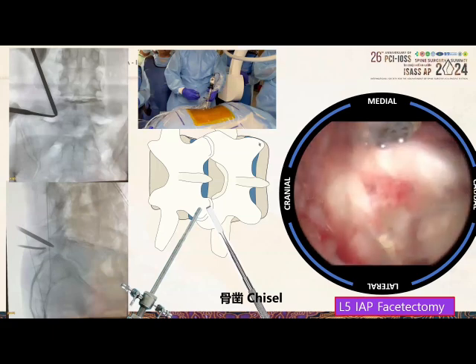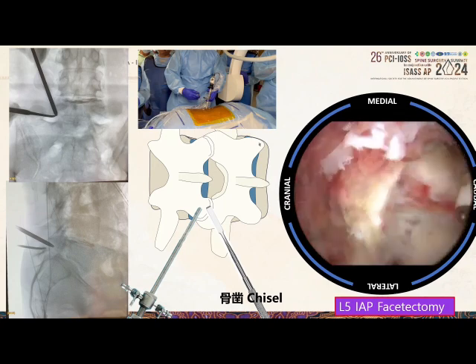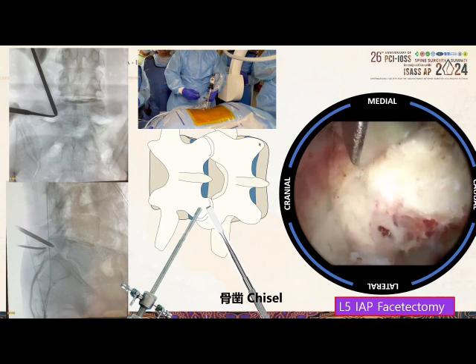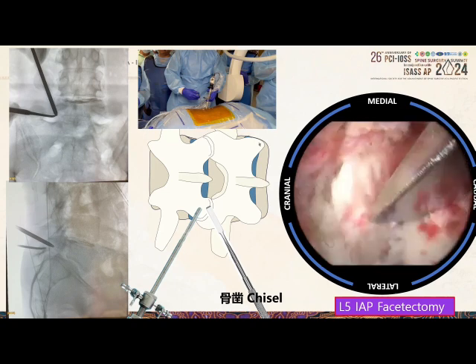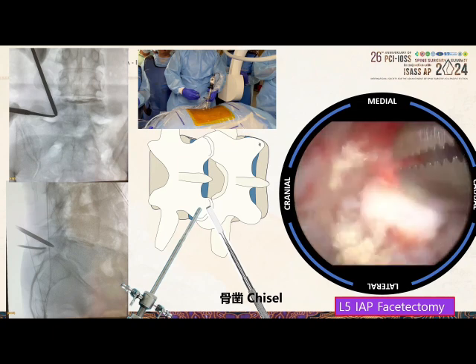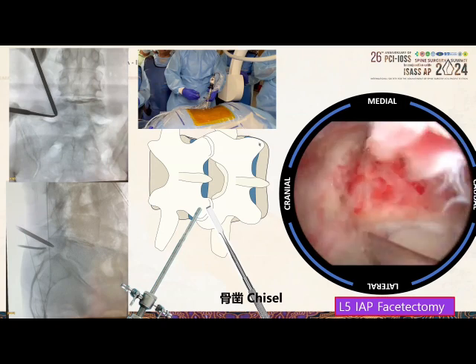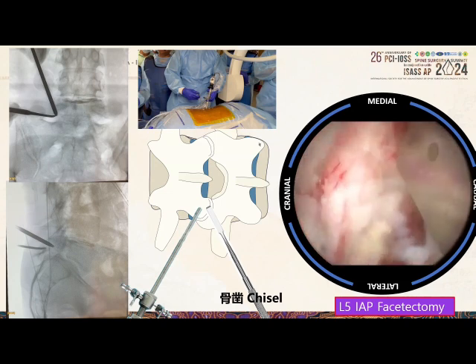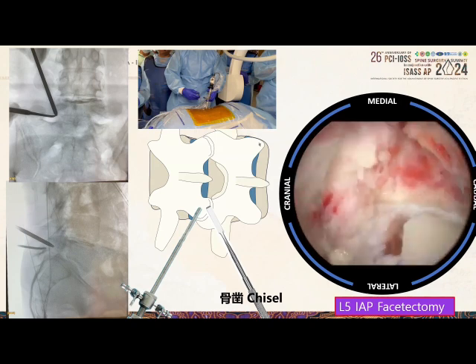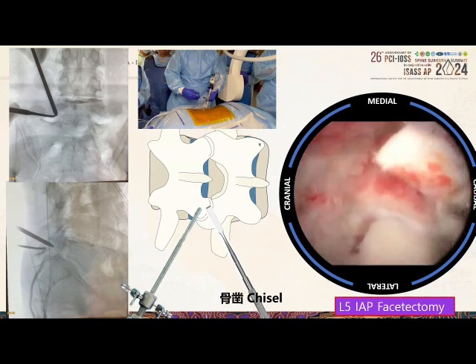Using a chisel, we remove the inferior articular process piecemeal, as it is sometimes challenging to remove it entirely in one piece. Using a chisel is advantageous because we harvest the bone in large blocks rather than bone dust as produced by a drill. A retraction device — metallic or plastic — is useful. We then remove the lateral and then the medial part of the inferior articular process.